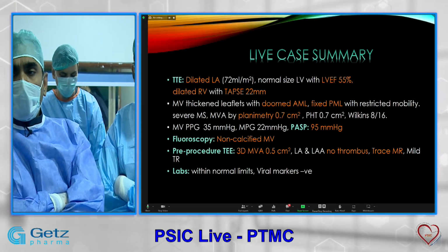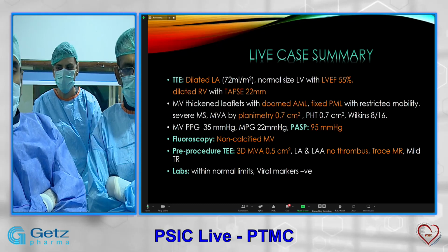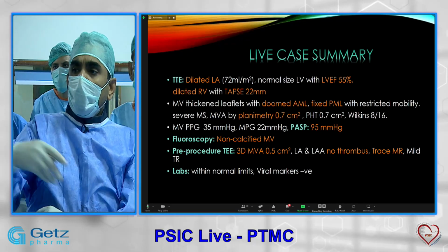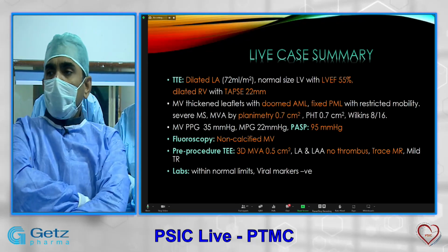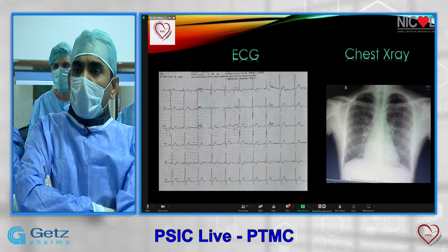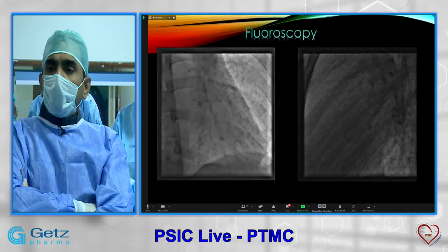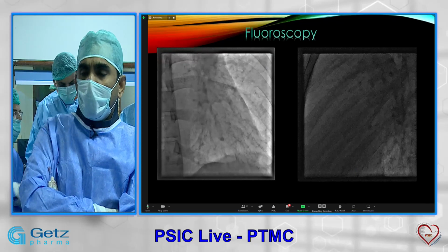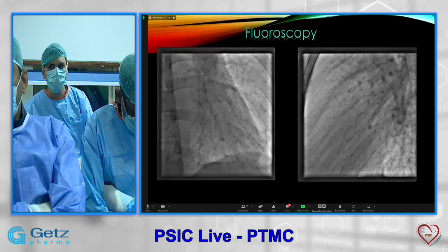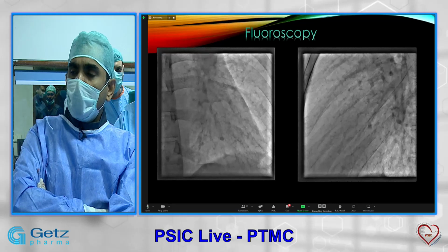We did fluoroscopy, and there is no calcification, and we did a TEE to rule out LA thrombus and MR. I can show you the next, please. This is the ECG and X-ray. Next. This is the fluoroscopy; we routinely do fluoroscopy before the procedure in RAO and lateral views. There is no calcification seen in this fluoro.